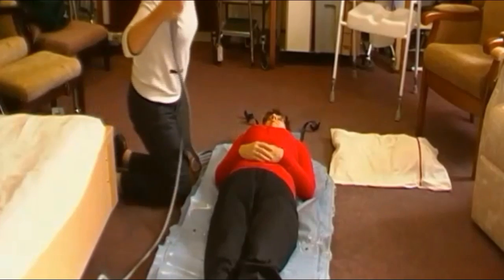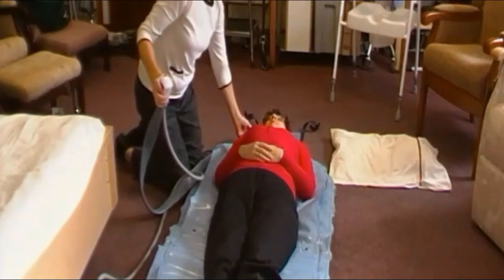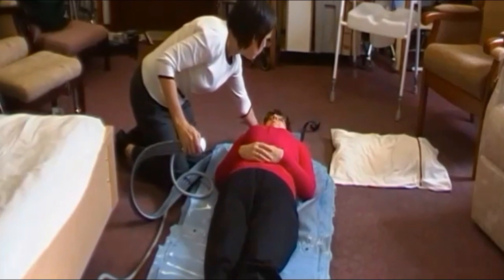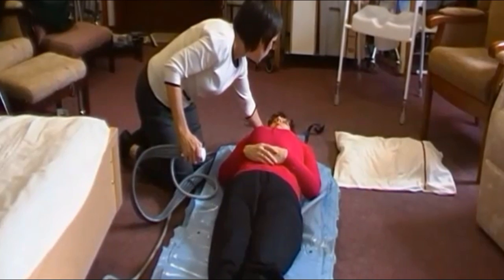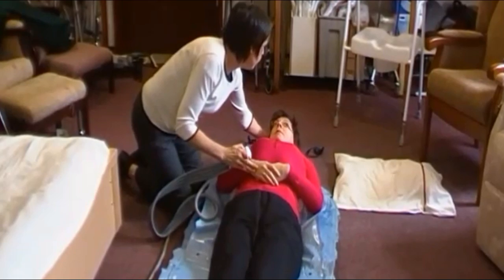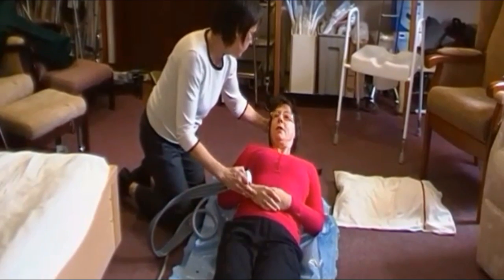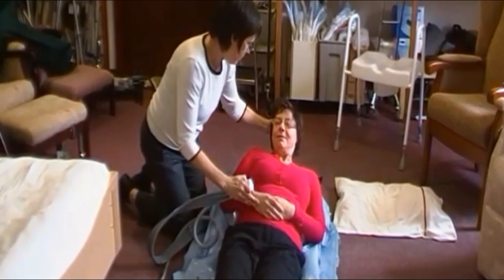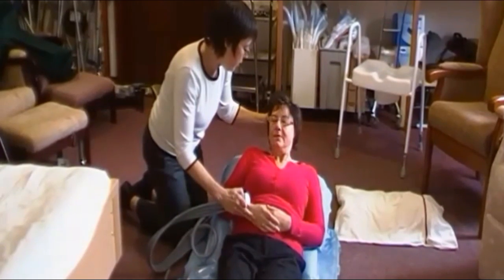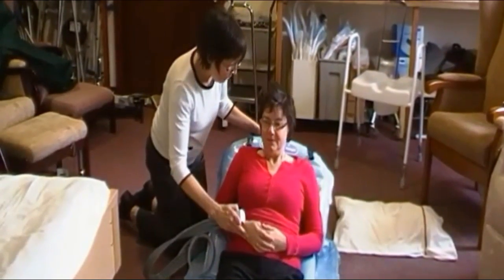Right, now what we do first, we press button number 1, and that will bring Christine into a slightly elevated position. So you may need to support the person's head. I'm just going to sit you up. Just bring you up until you're comfortable.